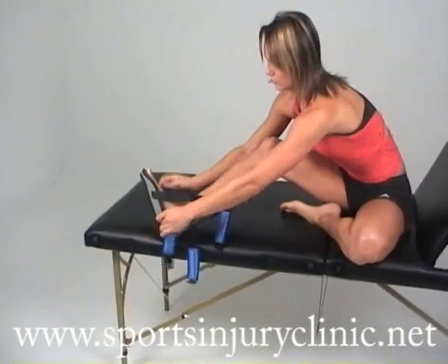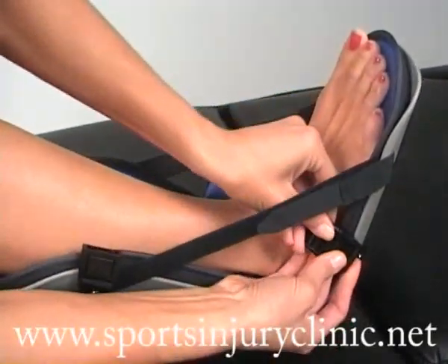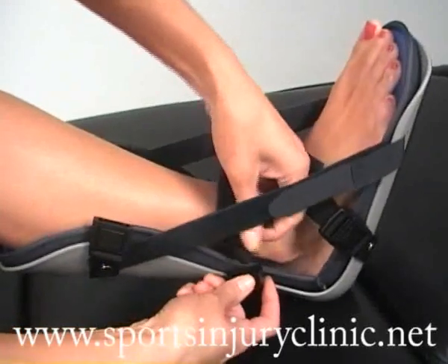The plantar fasciitis night splint is an excellent piece of kit for treating plantar fasciitis heel pain. Simply insert the foot into the night splint and secure the straps with quick release clip fasteners.